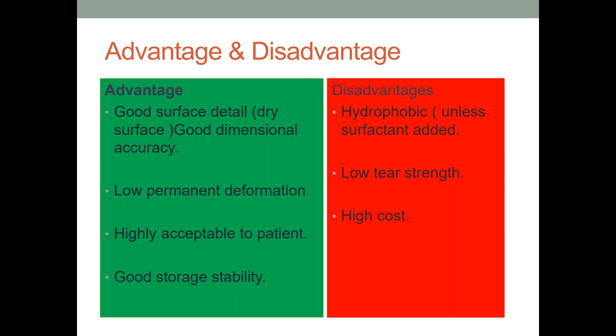Then the advantages and disadvantages. Advantages: good surface detail, but again both the materials are hydrophobic in nature, good dimensional accuracy, low permanent deformation, highly acceptable to the patient, good storage stability. Whereas disadvantages: hydrophobic, low tear strength and high cost. This is all about the addition silicone.